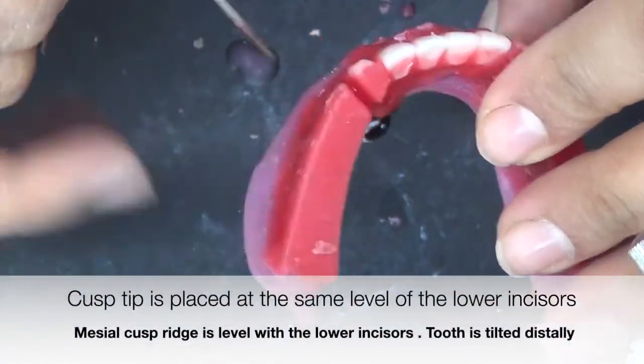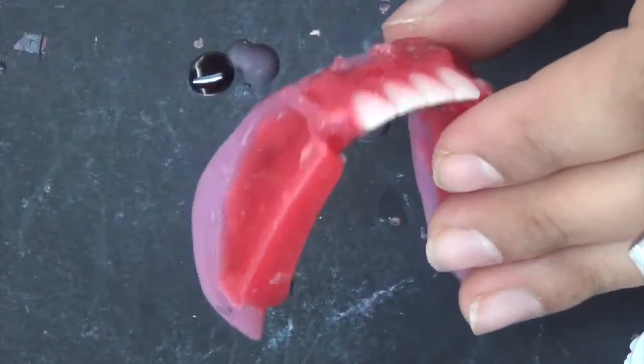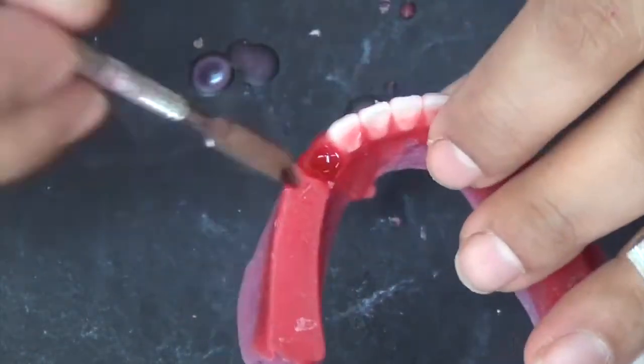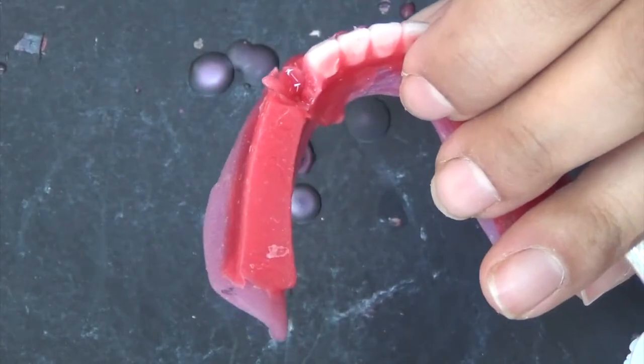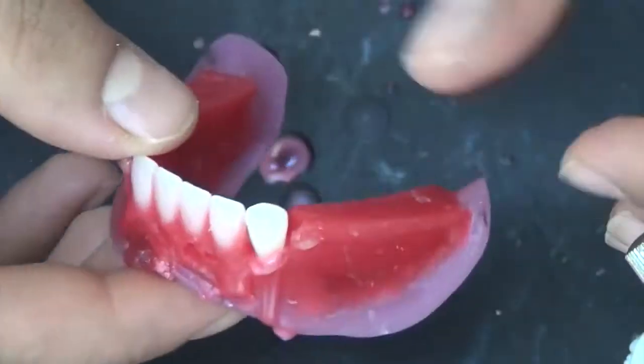Place the mandibular canines with the mesial cusp ridge at the same level of the lateral and central incisors, and the cusp tip is placed at the same level of the mandibular central and lateral incisors. The neck of the tooth is slightly prominent and tilted to the distal.